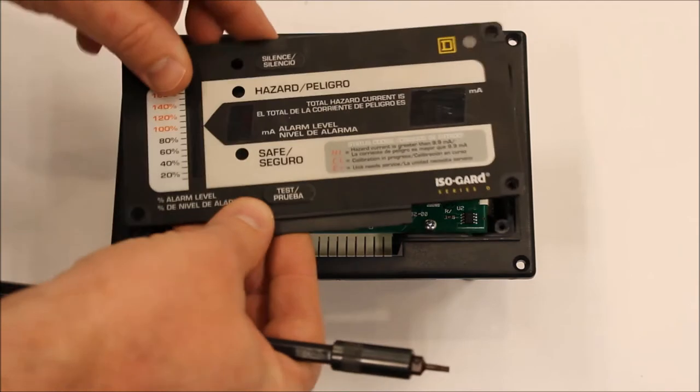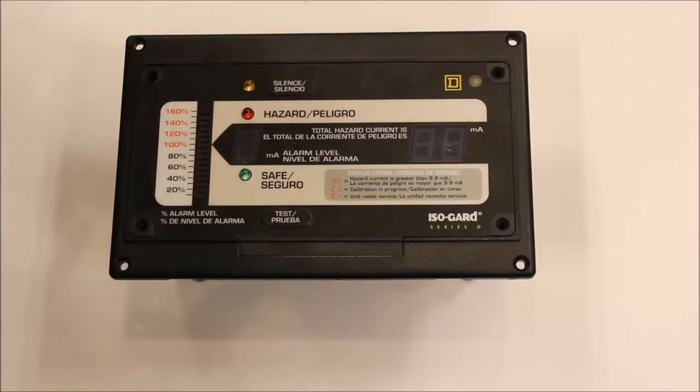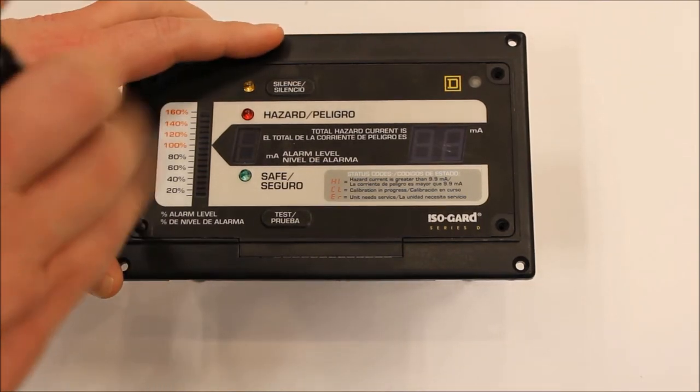Having completed the fuse change-out, secure the limb faceplate with the four cover screws, and return the limb to service.